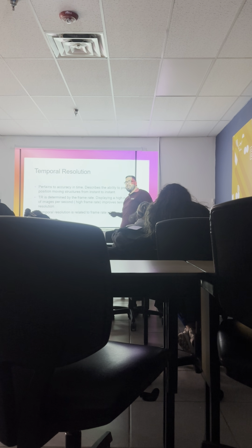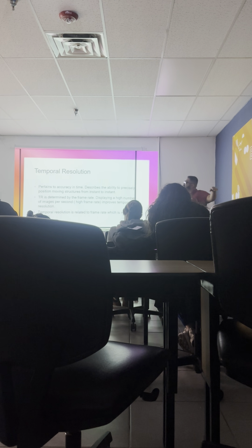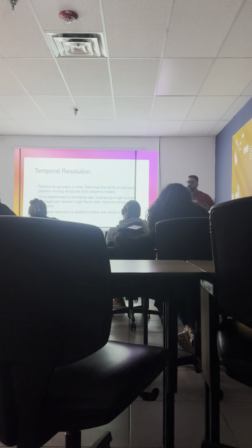Okay, you guys remember that video that I showed you of that bird that looked like it was floating? Did that have poor temporal resolution or improved? Poor, right? Because we couldn't see the wings flapping. If it was improved, you would be able to see the wings flapping up and down, right? So when in ultrasound do we need improved temporal resolution?